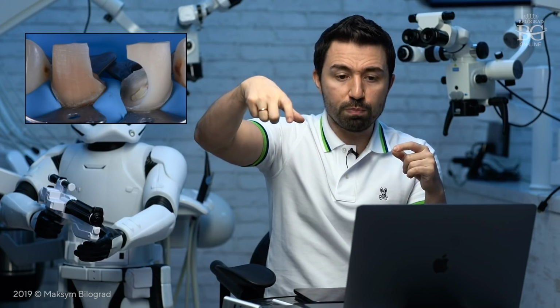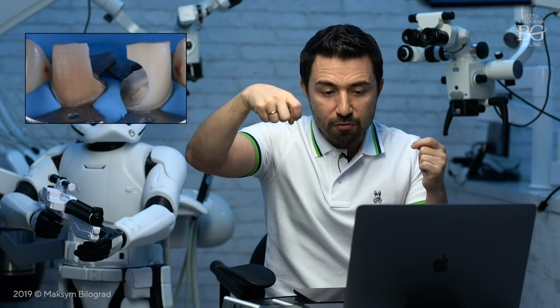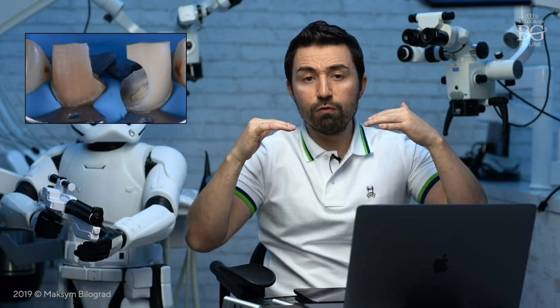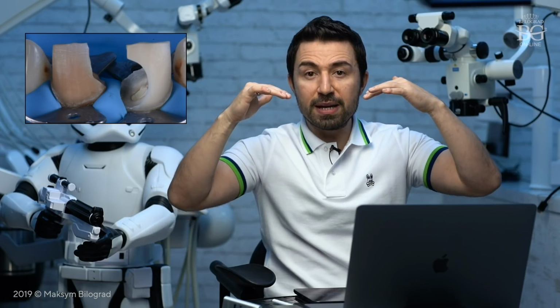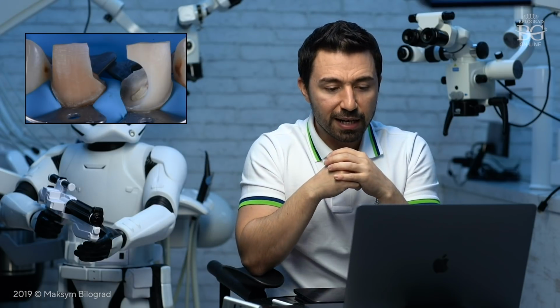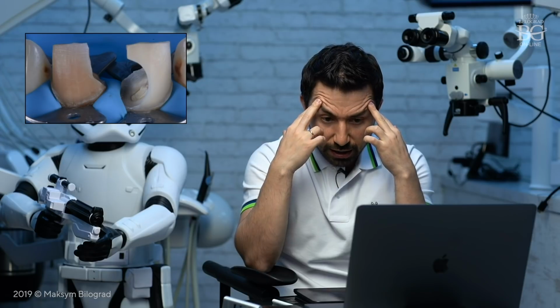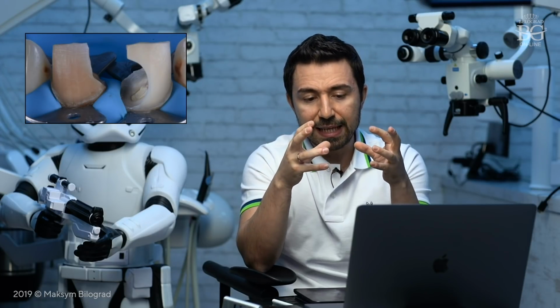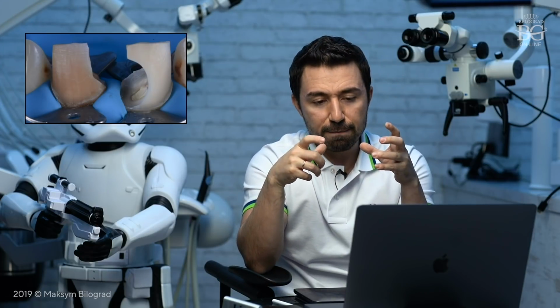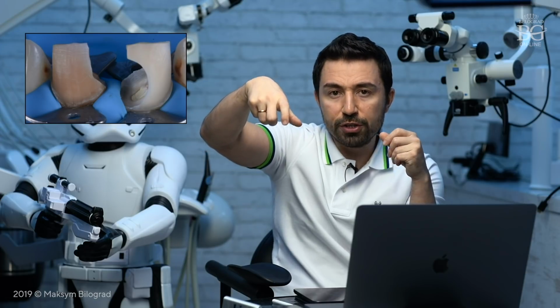It was stable, but it was stable only while I was holding this clamp. Once I removed the forceps from this clamp, it was moved really slowly by the rubberdam coronally, and afterward the clamp was running away. So I was thinking how to stabilize this clamp, how to prevent mobility of this clamp. So basically, we have to push something and hold this clamp in that place.